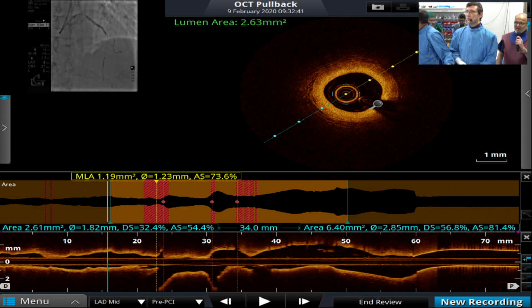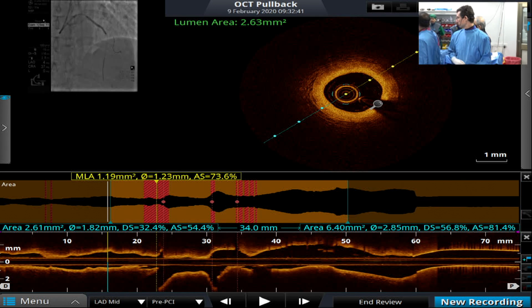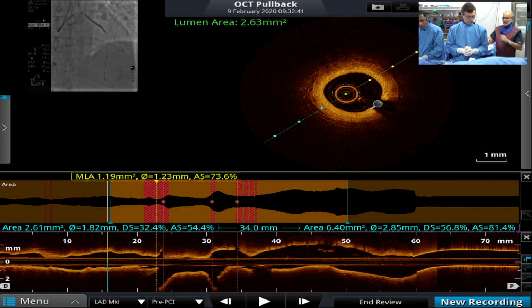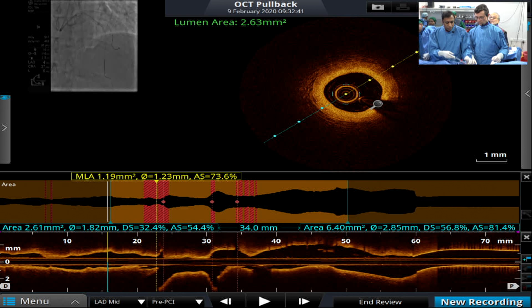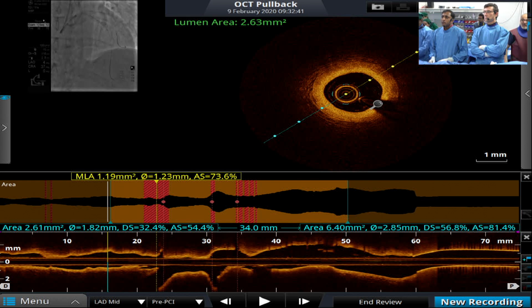Louis, he inflated at 10 atmospheres, you rightly said, a little bit of pull, and 20. Any 2.75 by 15? Yeah, get NC track. Okay, perfect. You want to check the result? You checked it? So you can see here how the balloon is pushing the stent towards the side branch very well. Look here, negative residual distally with 2 also at 10 atmospheres.